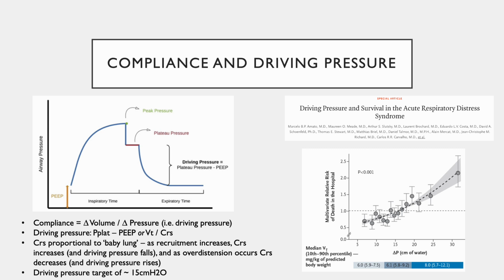As previously alluded to, critiques of this compliance and driving pressure methods contend that cyclic opening and collapse of lung units during tidal insufflation may cause changes in tidal compliance not related to recruitment, confounding the reliability of such a method. Nonetheless, it remains a fairly easy tool to use at the bedside and could provide some degree of safety netting in our overall ventilation strategization. Meanwhile, we await results from the DRIVE RCT to validate the use of driving pressure as a means of setting PEEP.